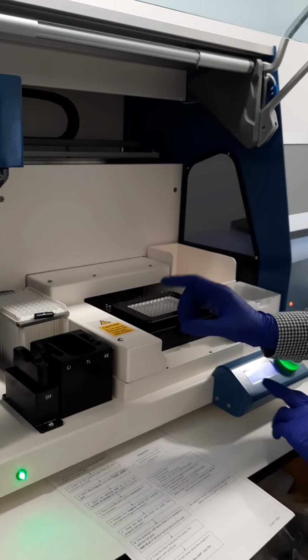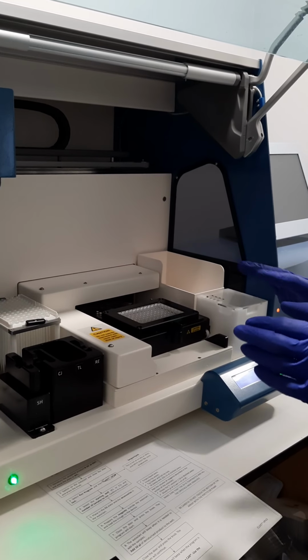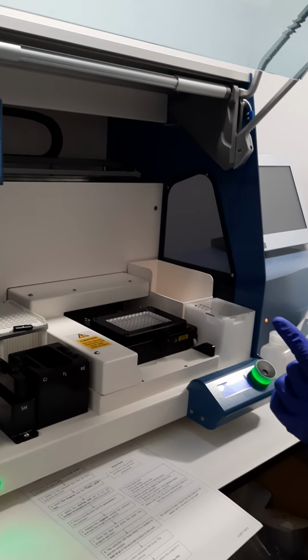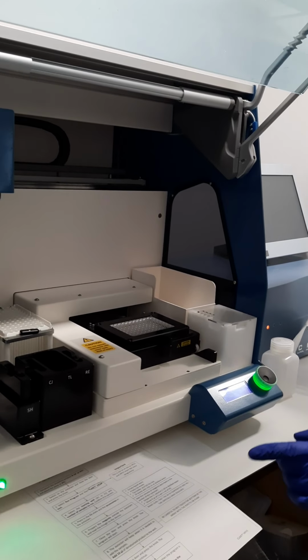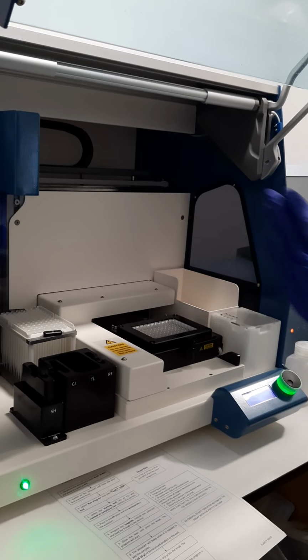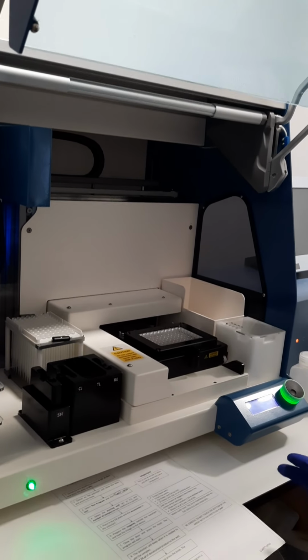We have to prepare the TL. We have a small bottle. We have to prepare a dilution. For example, for the 8 samples it is 1 milliliter of TL plus 9 milliliters of distilled water. We have also over there a table with the volumes for 8 samples, this and this, and so on, so you don't have to do calculations.